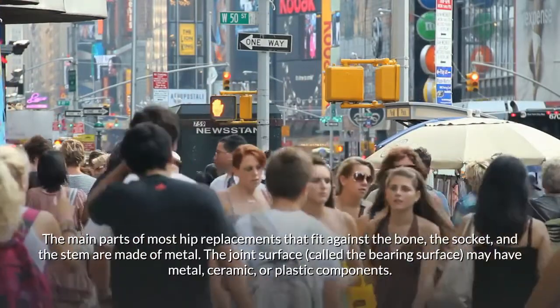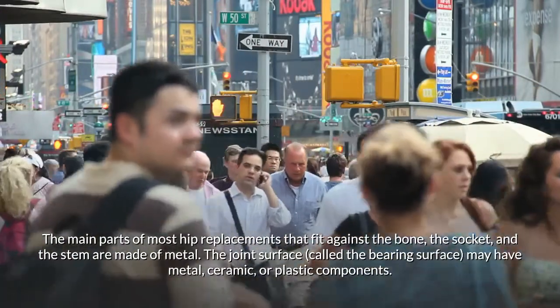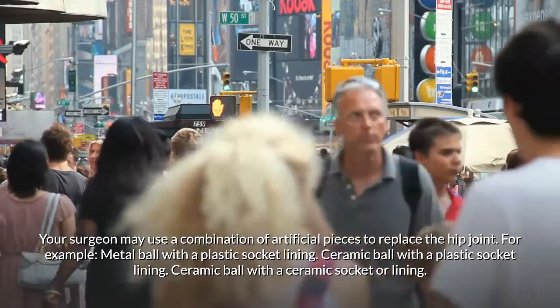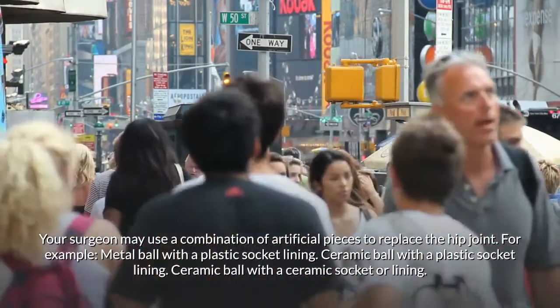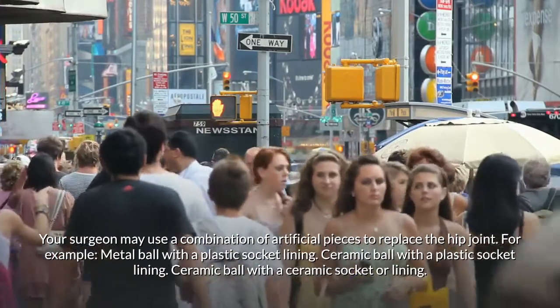The joint surface, called the bearing surface, may have metal, ceramic, or plastic components. Your surgeon may use a combination of artificial pieces to replace the hip joint — for example, a metal ball with a plastic socket lining, or a ceramic ball with a plastic socket lining.